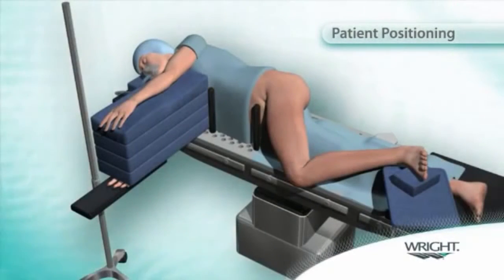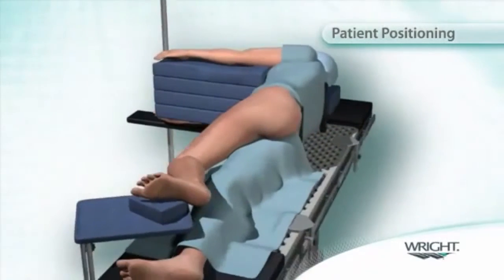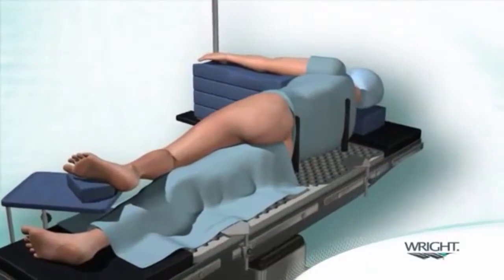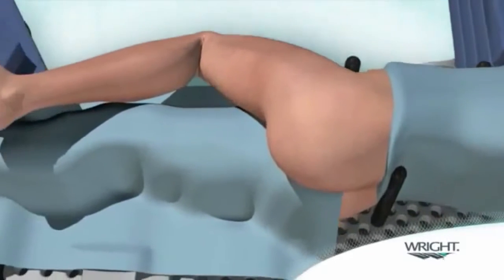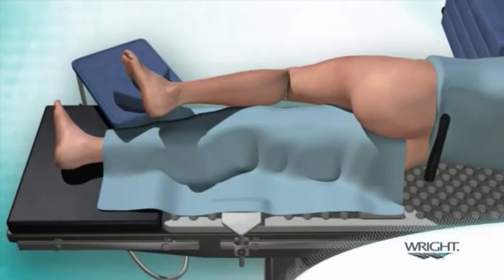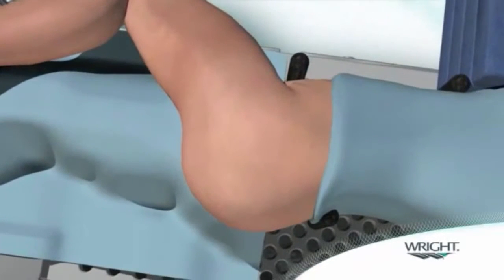The patient is secured in a lateral decubitus position on the operating table, preferably with the use of a pegboard and radiolucent pegs to permit a good quality intraoperative x-ray. With the pelvis leaning slightly posterior, flex the operative hip 45 degrees and internally rotate the operative leg 10 to 15 degrees to orient the greater trochanter upward. Resting the operative foot on a padded Mayo stand with the leg in slight adduction, the weight of the operative leg will bring the pelvis to the balanced neutral rotation. This is the home position of the technique as the operative leg will remain there for most of the procedure.